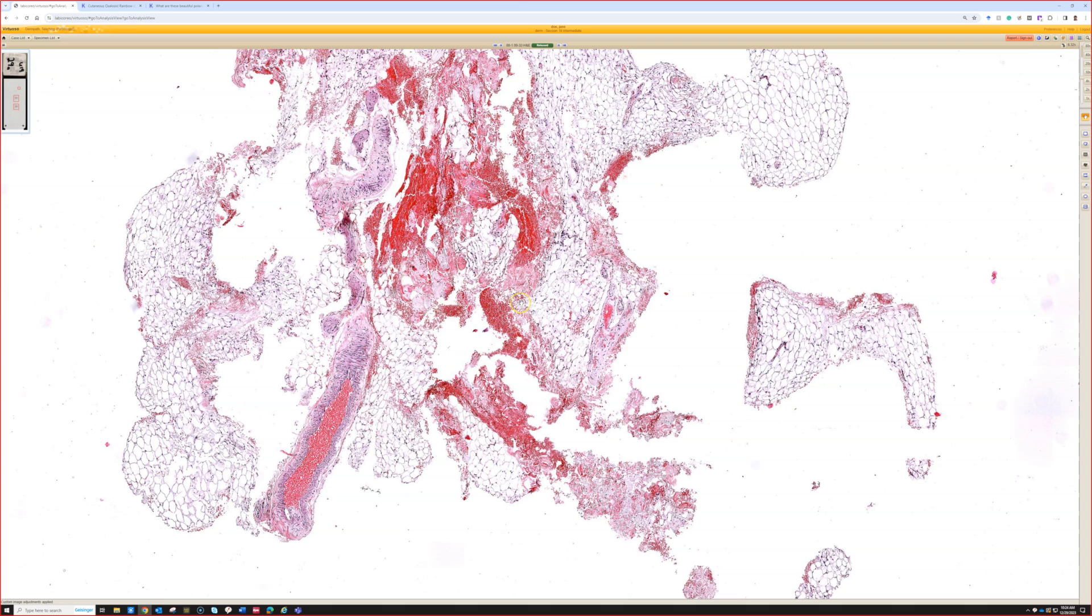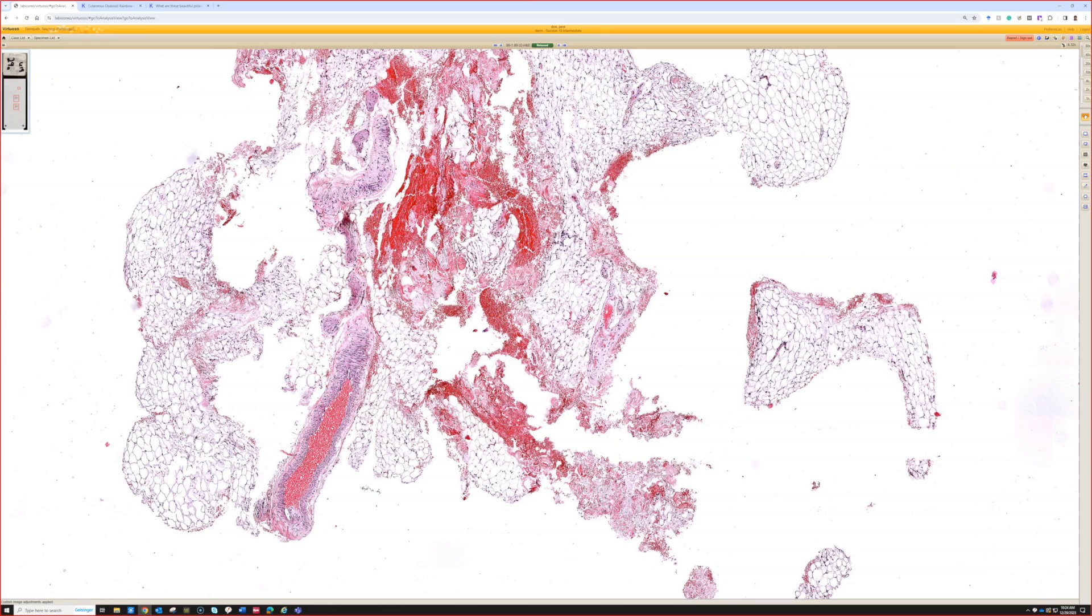The reason for that is that the amyloid, you can't tell where the amyloid will be deposited. It's not uniform and you may get focal deposits in between the adipocytes, you may get focal deposits in the walls of vessels.